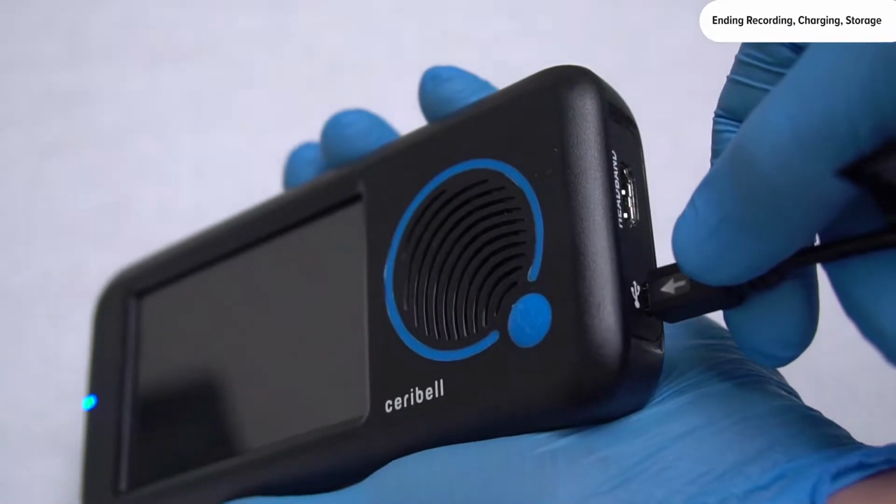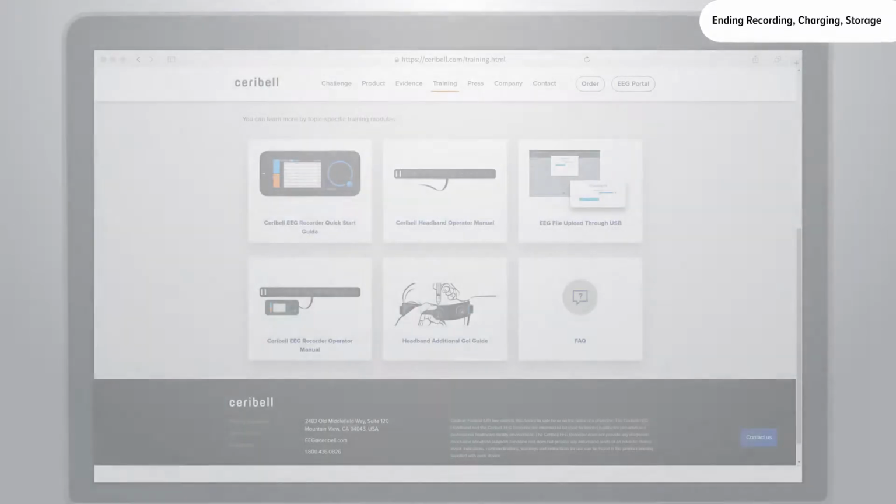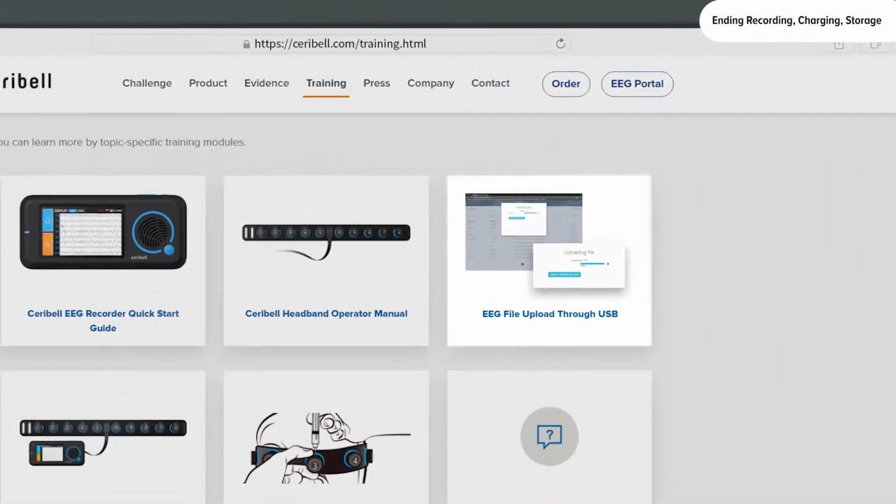We recommend monitoring every 2 hours to check for any signs of skin irritation or pressure sores. Also ensure that none of the electrodes are resting on the rolled towel or pillow. If skin irritation or pressure sores are noted, stop the recording and remove the headband. Notify the ordering physician. In the event the Wi-Fi upload does not complete, you can upload the EEG via USB. You can find an upload guide on the Ceribell training website.